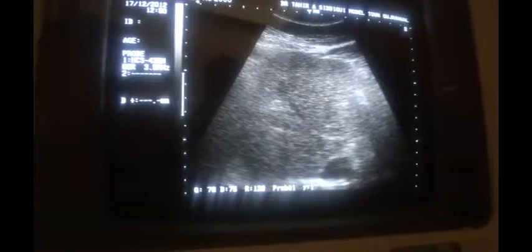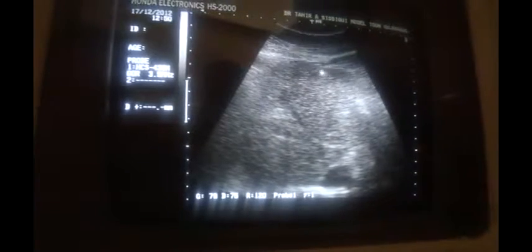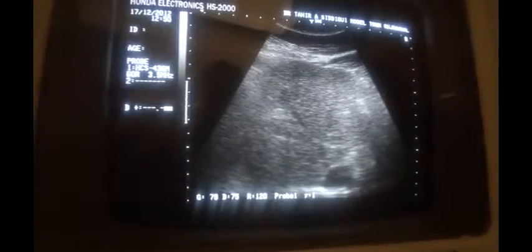This is a cirrhotic liver, and you can see the difference between the normal and this one. In this segment, the two main findings that we are seeing are the irregular outer surface of the liver, as well as not only the diffuse increased echogenicity of the liver parenchyma, but also coarseness of the liver parenchyma, with blurred vessel margins. This is the left lobe in longitudinal section.